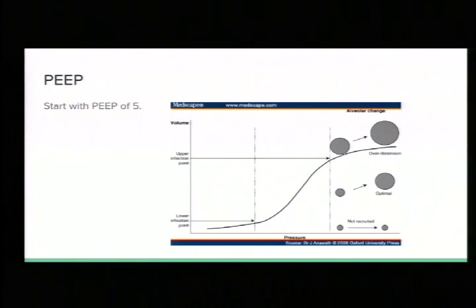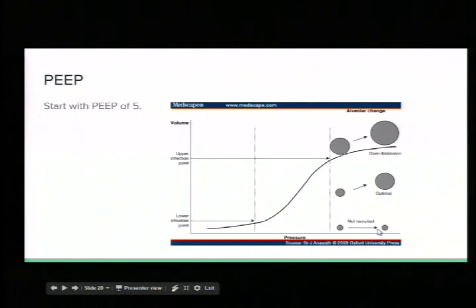Talk about COPD and asthma patients, you don't want to add PEEP on those. These guys, you want PEEP. It helps keep those airways open because they've got fluid, they've got trauma to them, so they need a little support to keep that airway open from collapsing. So if you look at this slide, it talks about recruited alveoli. Nothing down here, so there's nothing to help keeping it open. This keeps it somewhat open, and you get airway improvement, opens it further.